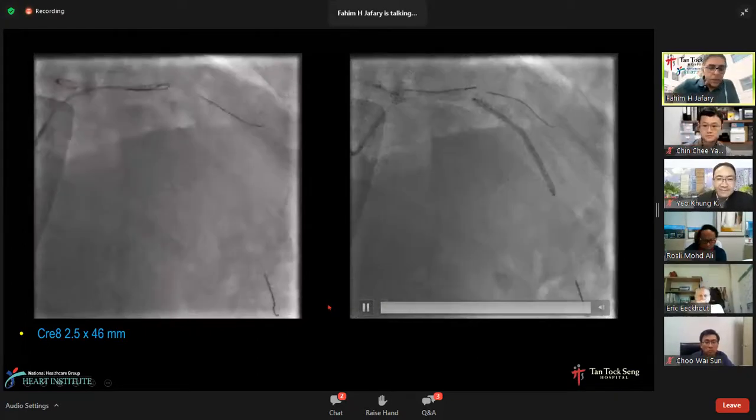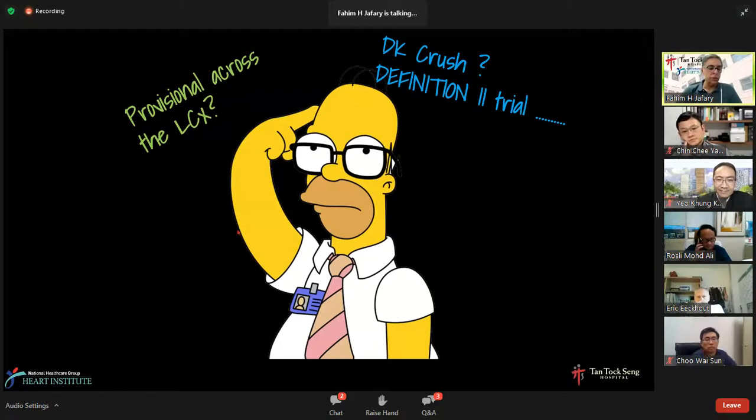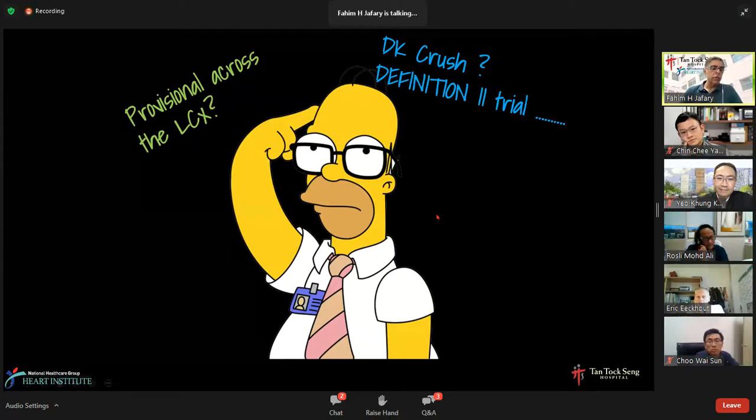And then the question comes: now what do I do? Do I do a provisional approach across the circumflex? The ostium of the circumflex isn't really that bad, but it's not totally normal. Or do I do a DK crush? And the thought that occurred to me was what you just heard Dr. Chu talk about, the DEFINITION II trial.